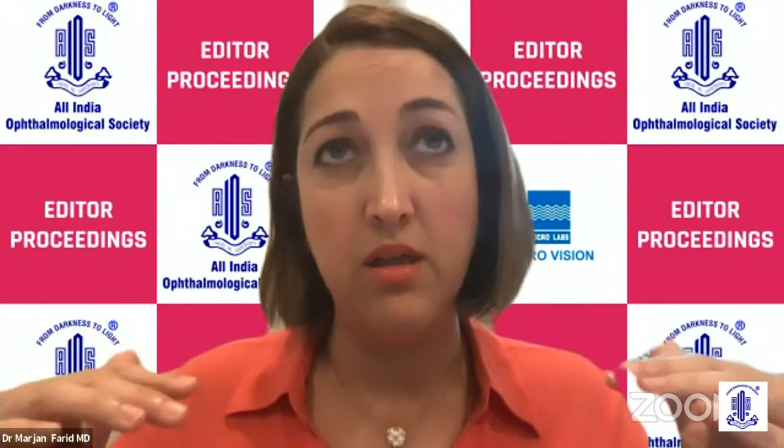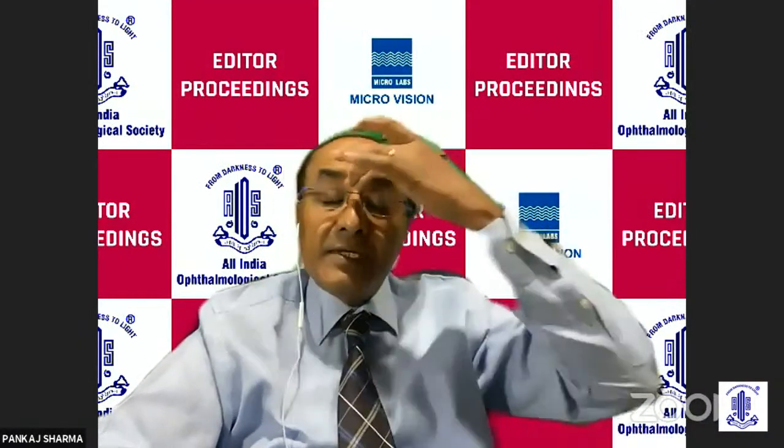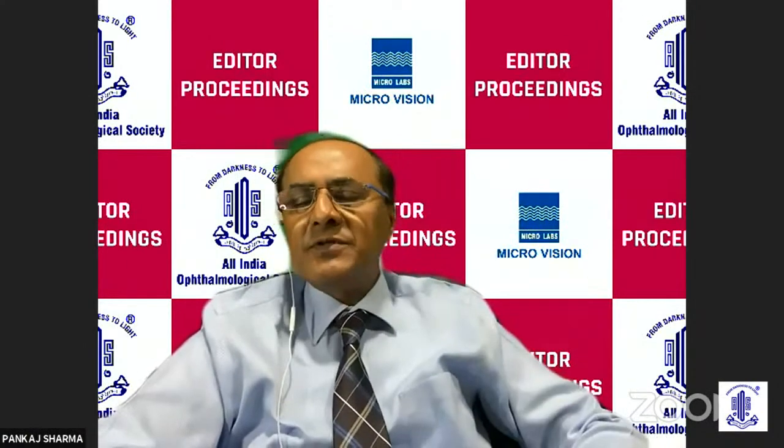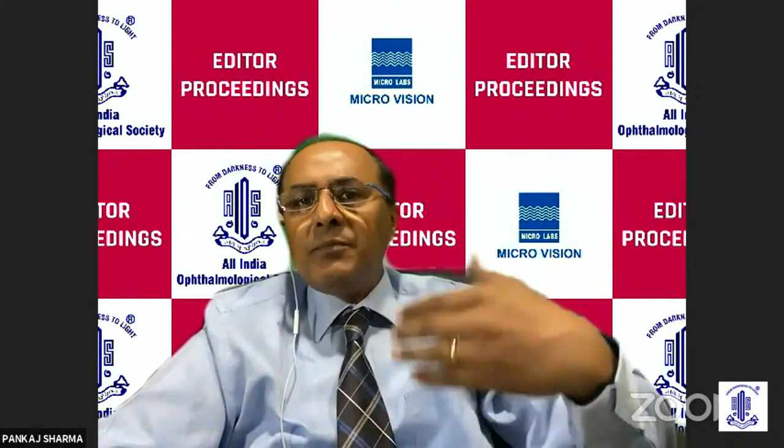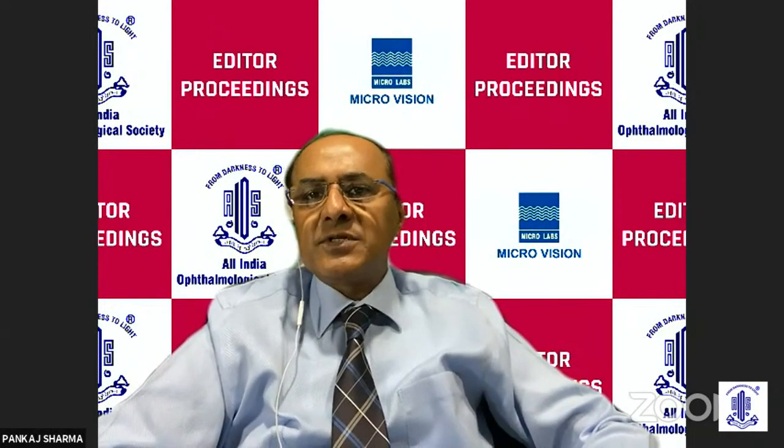If I really hit a wall in terms of how much I can turn around and I still feel the ocular surface is not pristine the way I want, those are patients that I may steer away from a multifocal optic. Yeah, and the other thing is that even if the ocular surface is not so good, post-operatively the patient won't be happy. So we might as well treat the patient first.